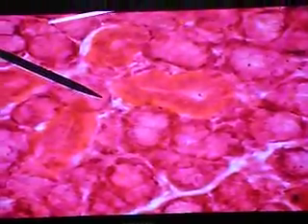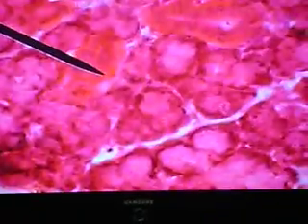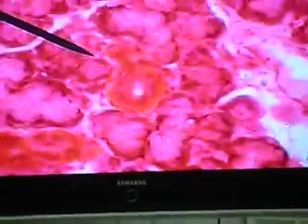Cuboidal epithelium. So in this section here, the species of duct that we're seeing predominantly are the striated ducts. Nearly all the ducts that we're seeing in this section here are striated. They're nearly the bulk of them. This little one here, that's where intercalated is going to become a striated. That's the interlobular connective tissue once again.